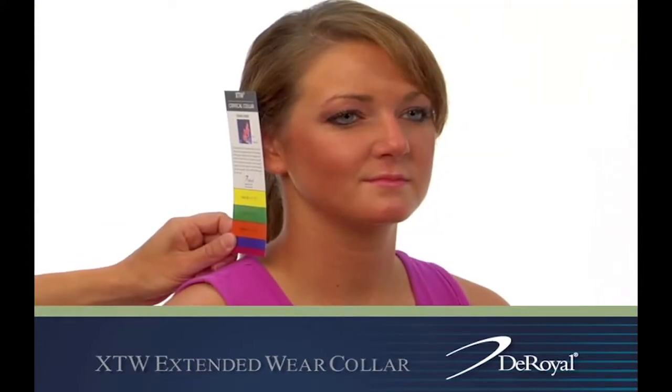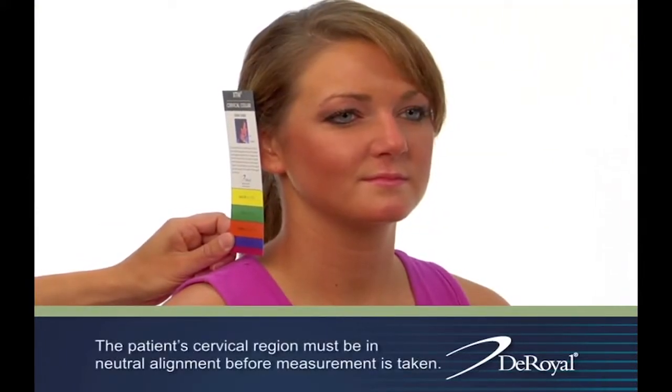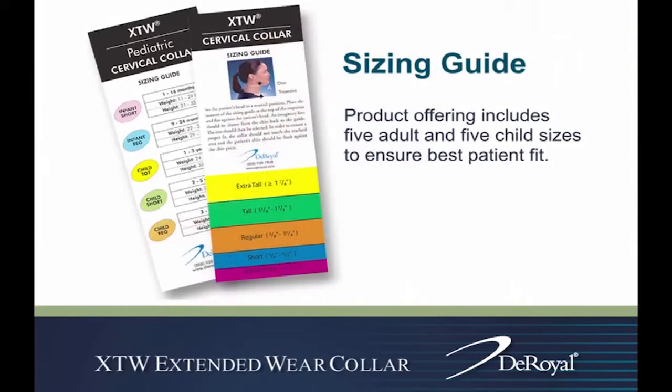With the patient in neutral alignment, measure the vertical distance from the tip of the chin to the top of the shoulder. Select the correct collar by referring to the size guide.